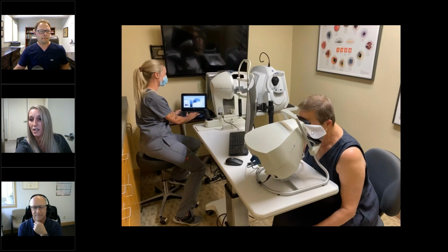and that actually helps with not only lighting, but it does block the other eye from seeing. So there's these two chin rest dips. I'm going to use my hands to talk, because I always do. No, I'm not Italian. I just do. So they dip down, and then they're going like this, or the other way. And that blocks off the other eye, and they can't see. I mean, we put it to the test, and I've taken the test myself. Williams performed it on me, and you don't need a patch. You don't even need the lights to be off.